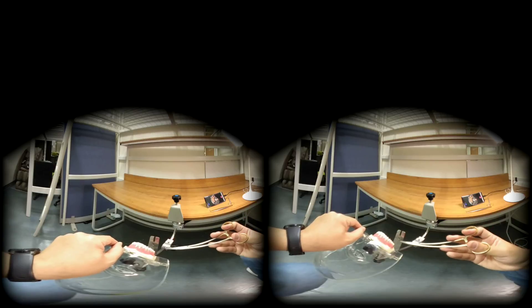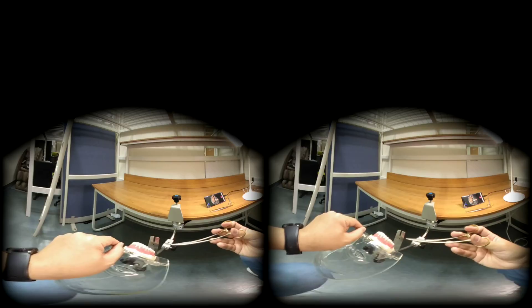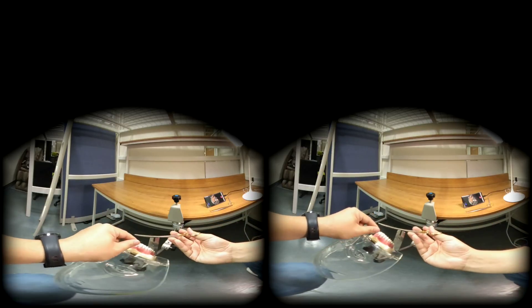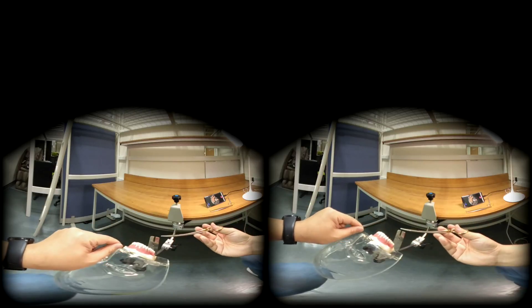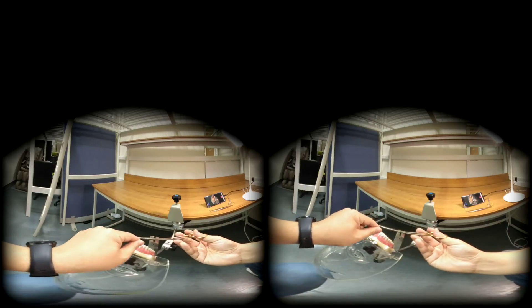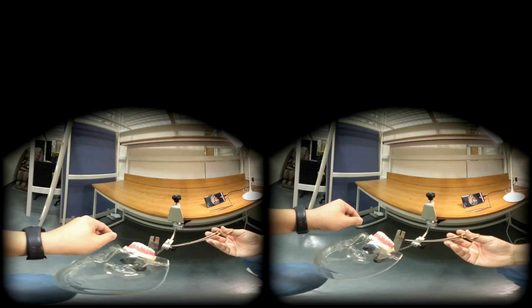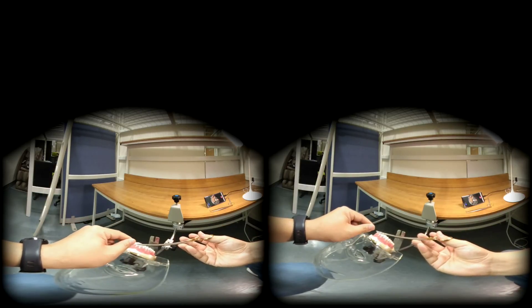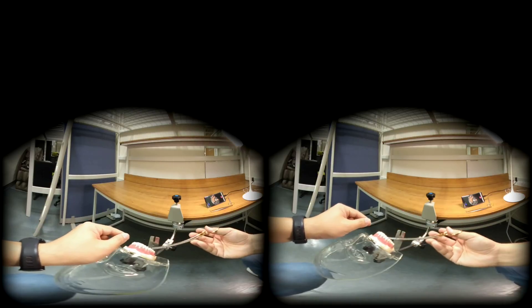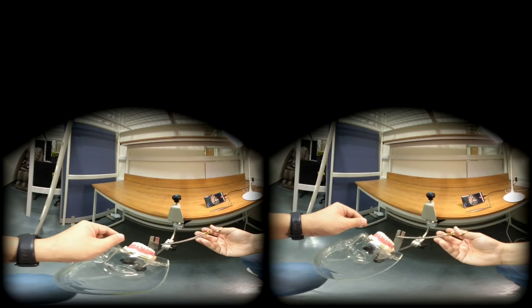So if you put your needle holder inside for the first throw, for the second throw you also put your needle holder inside again. If you prefer the outside rotation, you continue the same direction — for the first throw you put your needle holder outside, and for the second throw you put your needle holder outside the loop again. By doing that you create the surgeon's knot. If you do not, and if you mix the rotations, you end up having a granny knot, which easily loosens.